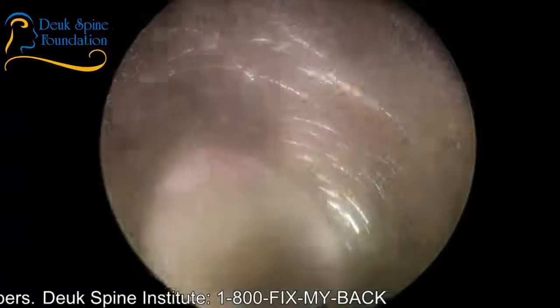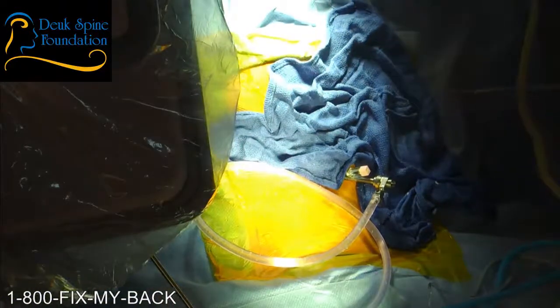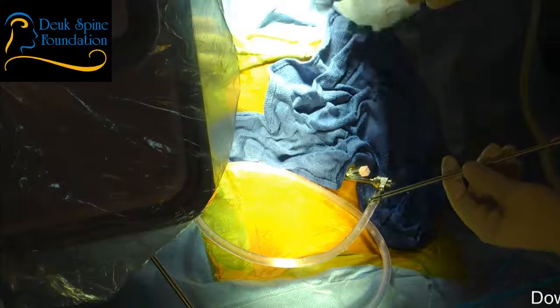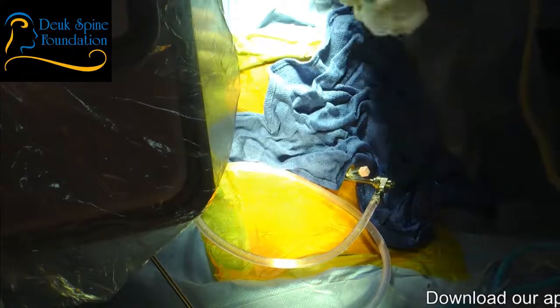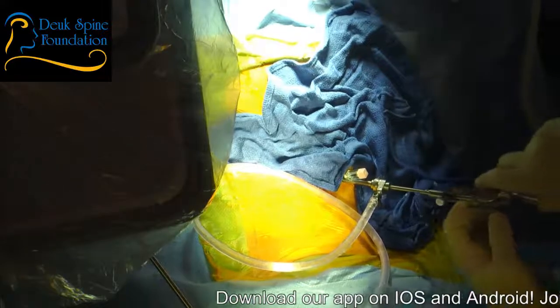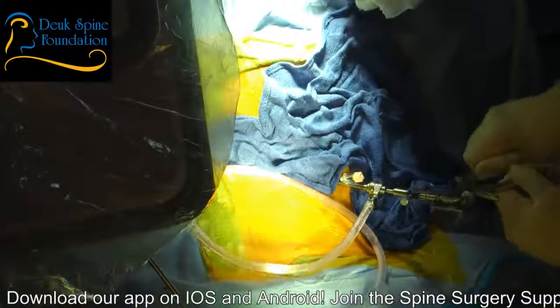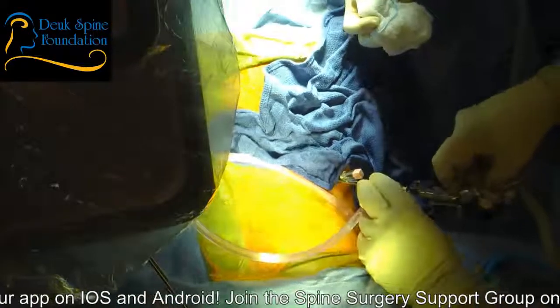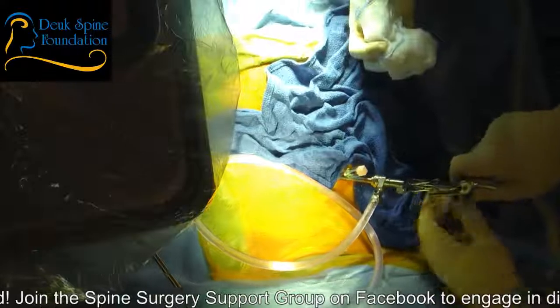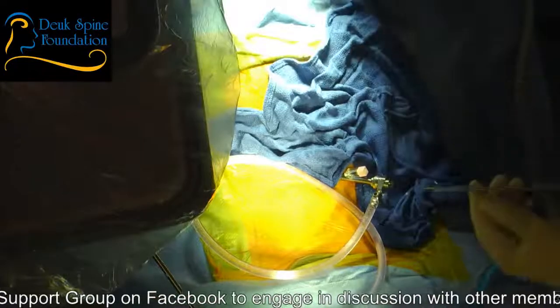Let's have the Grabzilla. For those of you wondering why we call it the Grabzilla, and whether or not there's any relationship to, yes, our favorite monster of all times, Godzilla, the answer is yes, there is a relationship. The Grabzilla is big and beefy. It's designed for one purpose, to do exactly what I'm doing right now, to go in and try to take the herniation out. And it's got a beautiful mouth to do it. It has a nice mouth that is pretty good at grabbing things, like herniated discs. Nice chunk right there. We just got a big chunk out.